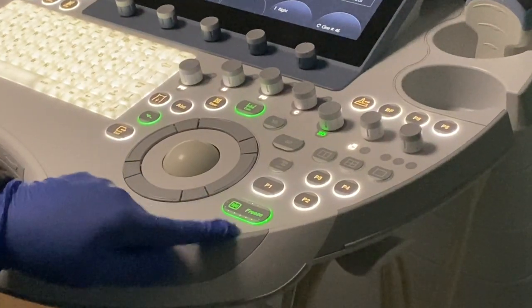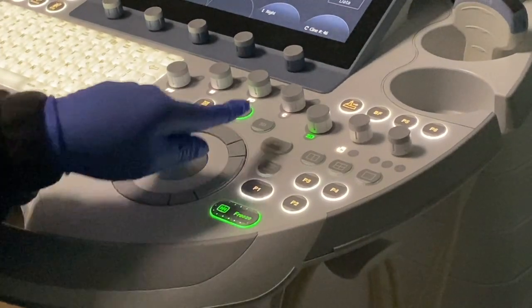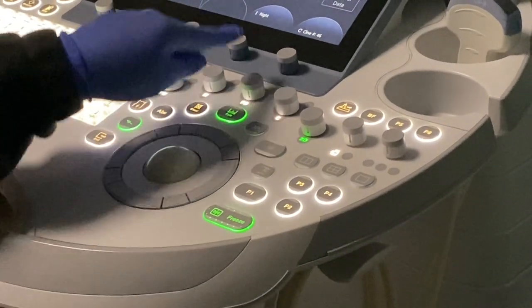The head circumference is measured in the same view as the BPD. The ellipse method of measuring is our favorite method as this has the least error. Of note, this measurement is taken from the outer to outer parietal bone, unlike the BPD. To calculate, freeze your image and this time select the head circumference option.